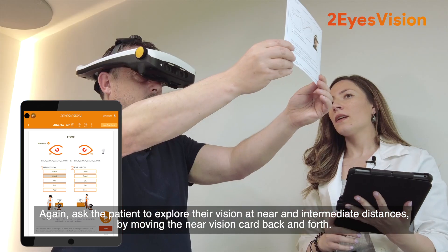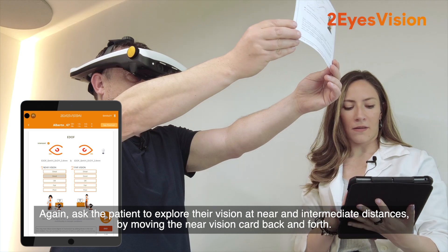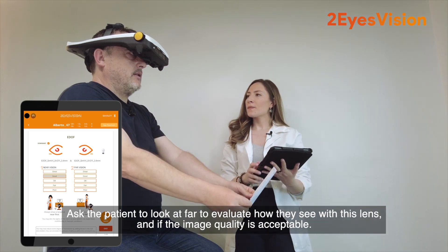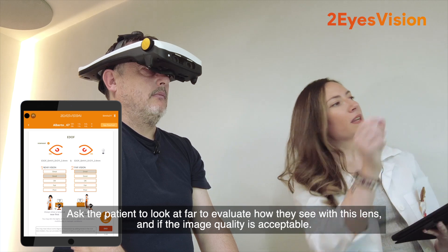Again, ask the patient to explore their vision at near and intermediate distances by moving the near vision card back and forth. Ask the patient to look at far to evaluate how they see with this lens and if the image quality is acceptable.